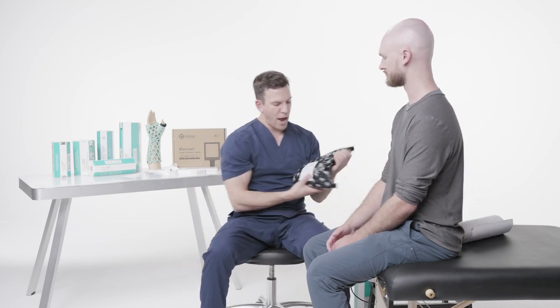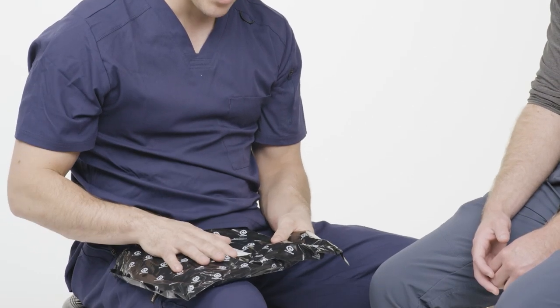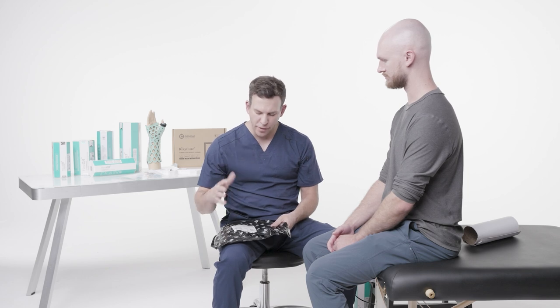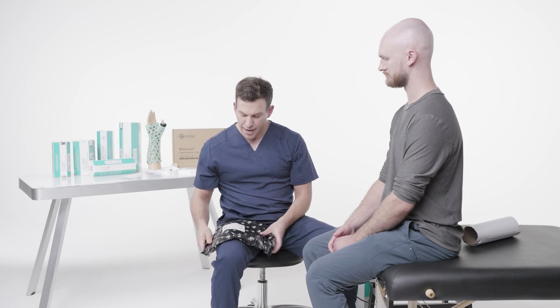The actual brace itself is inside this bag, and the brace is very light sensitive — any exposure to artificial or natural light will start the curing process. So it's important that we keep it unexposed inside this black bag.